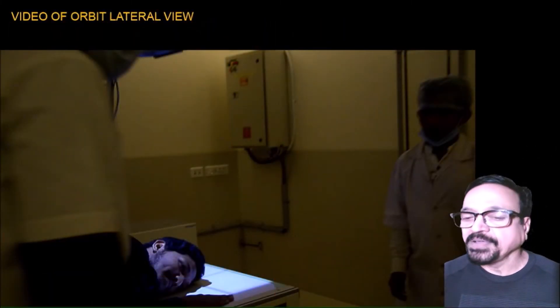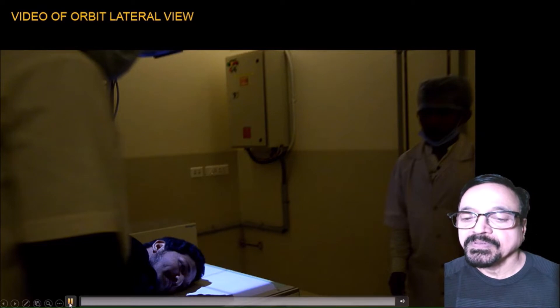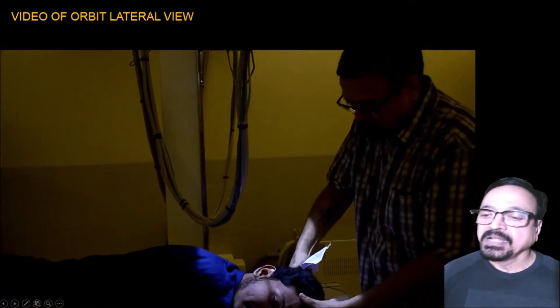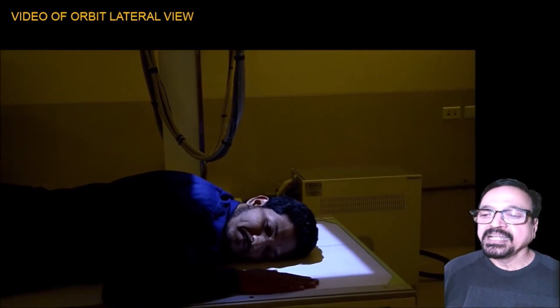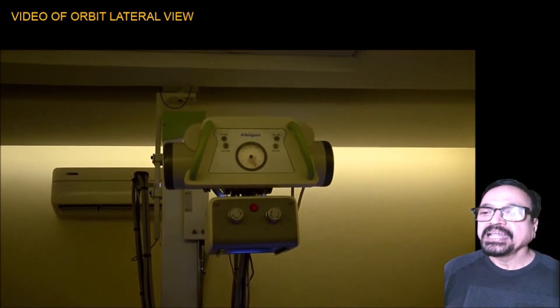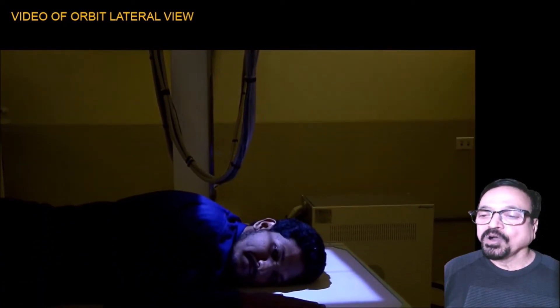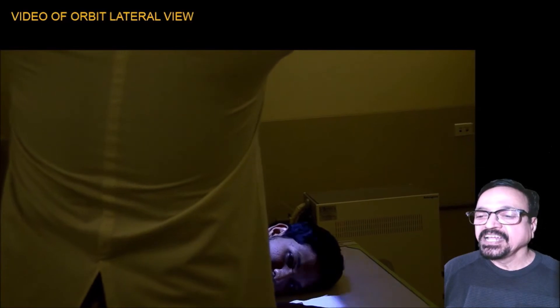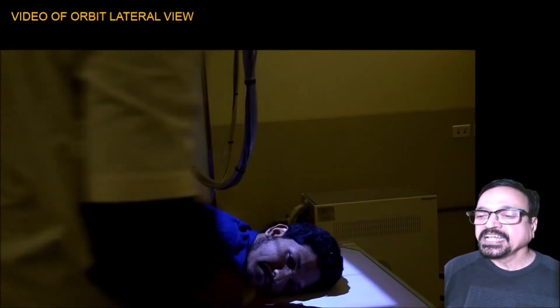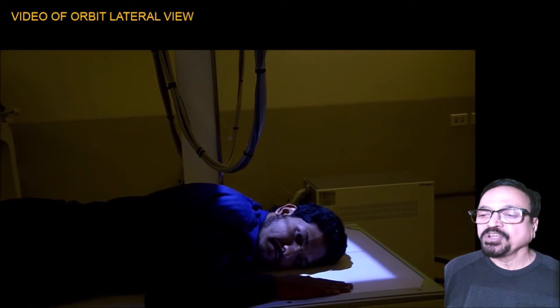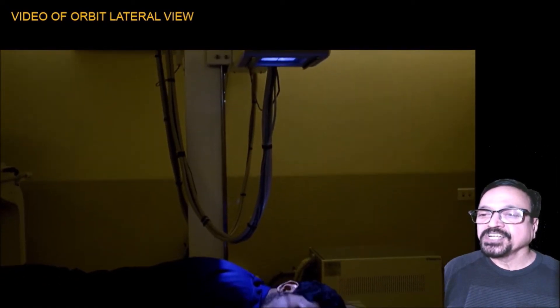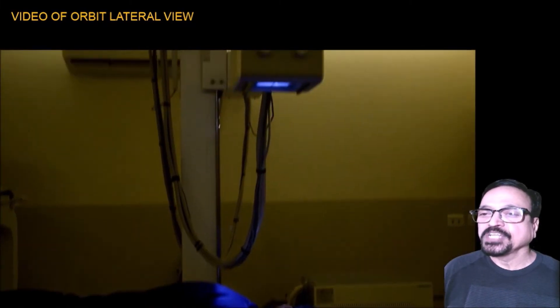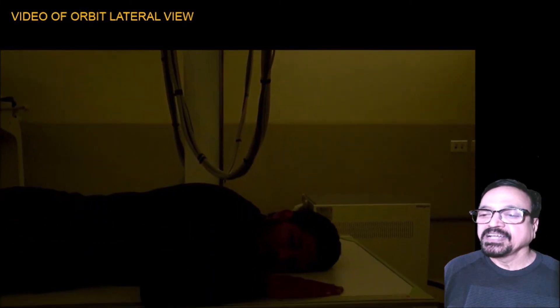Now let us see a video. The patient is lying prone. The angle is 0. The orbito-meatal plane is perpendicular. The inter-orbital line is in a straight line with no deflection. Press the collimator so that you get only the area of interest. Everything is set. The instruction to the patient is given that they should not move, and we are ready for the exposure. The exposure has been taken. The distance is correct and the beam is perpendicular.